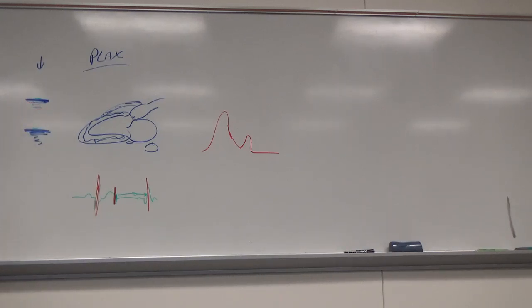Okay? So that's the philosophy of why they did leading edge to leading edge, starting way back in the M-mode days. M-mode was the first modality that they actually used before we got the 2D images. So everything is really based off how we used to do things with M-mode. So then, if we're scanning through that, would the leading edge technically be what we could just call the top layer, the first layer? Yep.